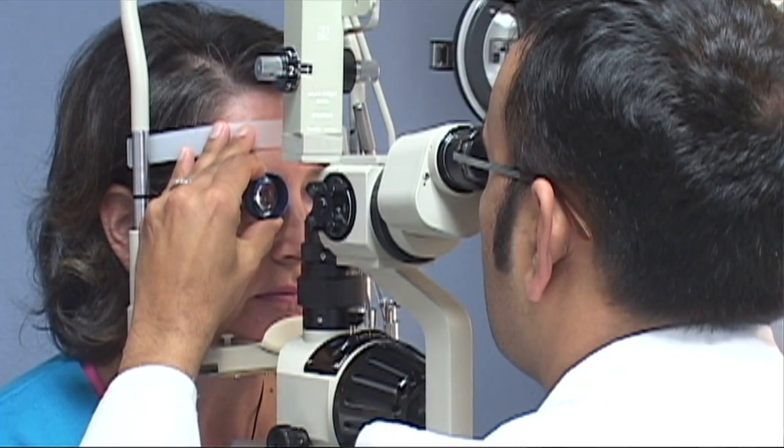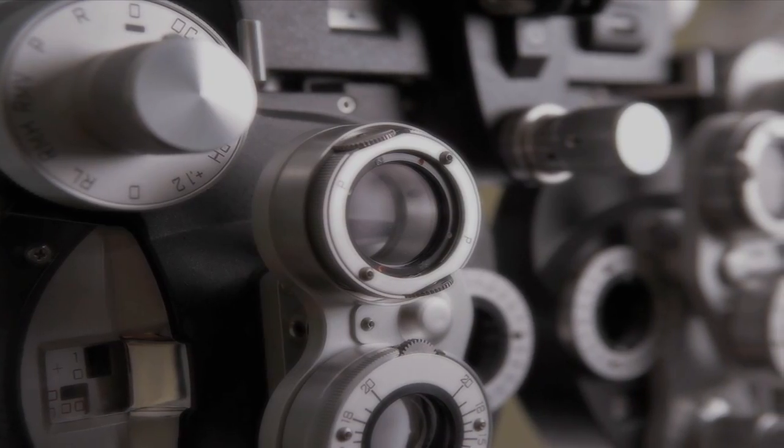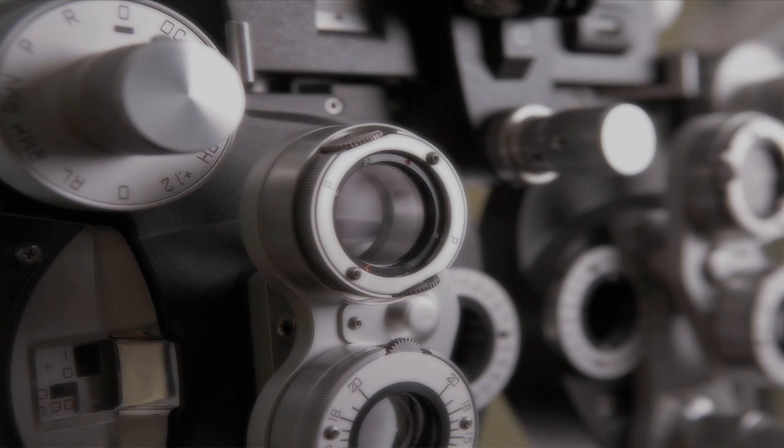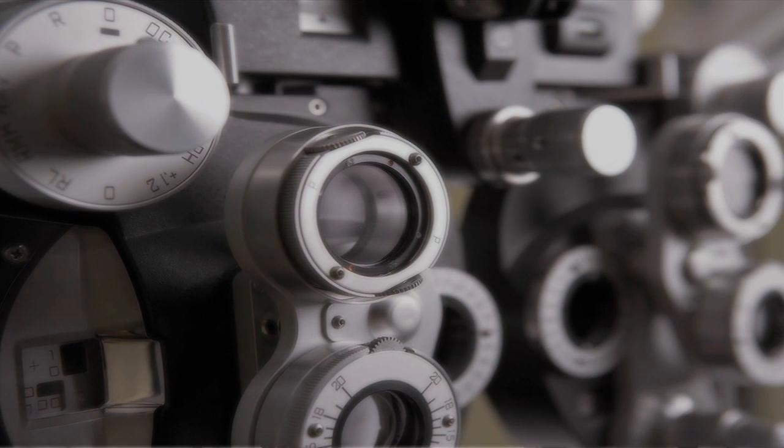that allows us to look at all the small details on the front part of your eye. And then we use an instrument called a phoropter, and a phoropter is that device that looks like a big fancy pair of eyeglasses that the patient sees through, and that's how we figure out what prescription would allow the patient to see better, both at distance and near.